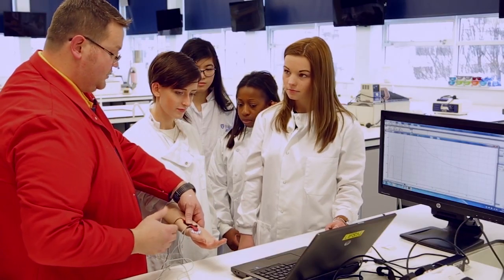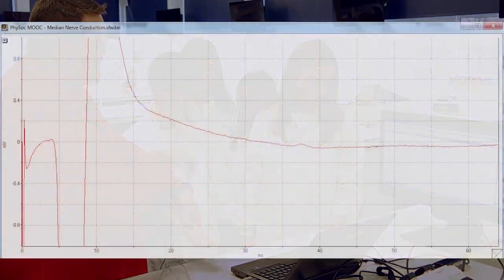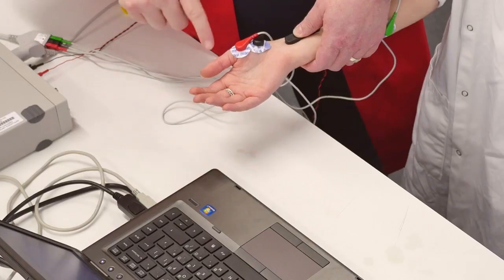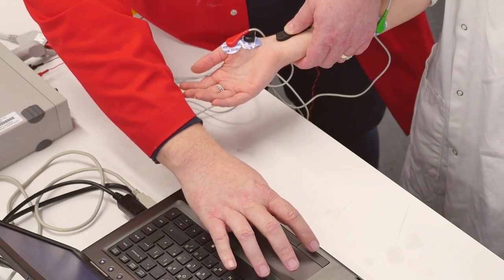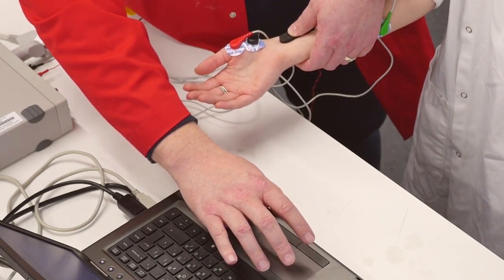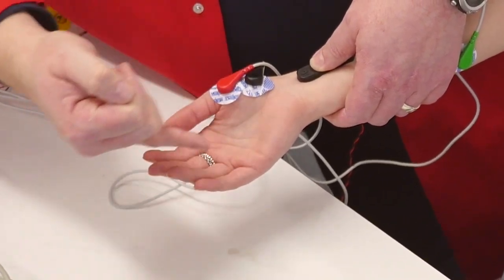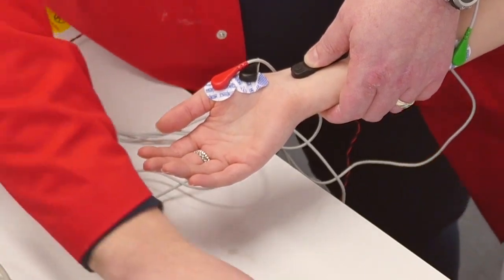There we go, we've managed to get it. The stimulus is super maximal at the moment — it's actually coming off the screen — but you can see the thumb. Every time we press start on the machine you'll be able to see that you get a stimulus, and we know we've got a single contraction of that muscle with none of the fingers twitching either.